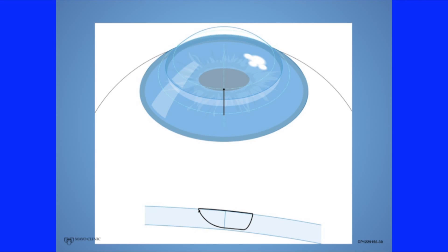Hello again, I'm Leo McGuire, one of the corneal specialists here at Mayo Clinic, and today in this fifth video we'll teach how to tie the knot once you've successfully passed the suture through both the corneal graft and the host. Our goal is to obtain good tissue approximation, neither too loose or too tight at the wound margin.